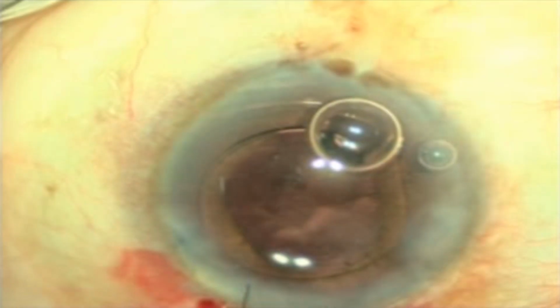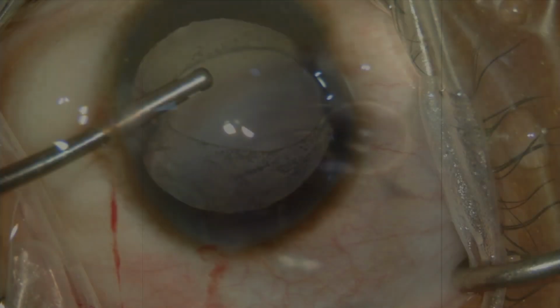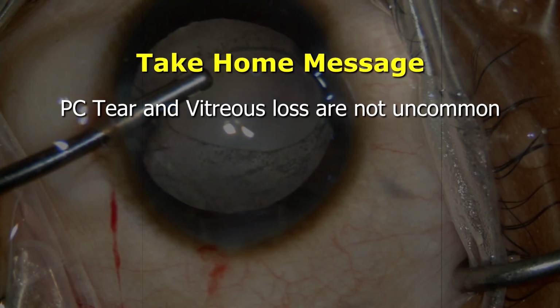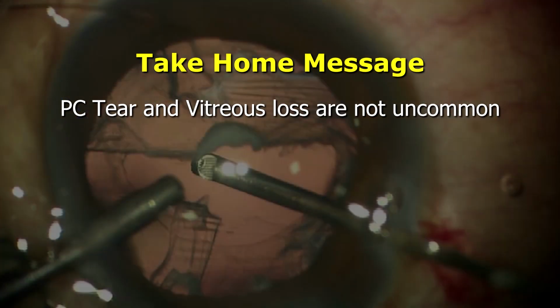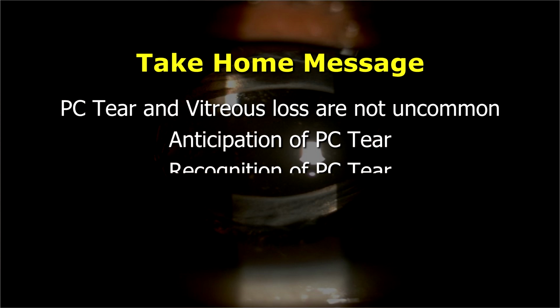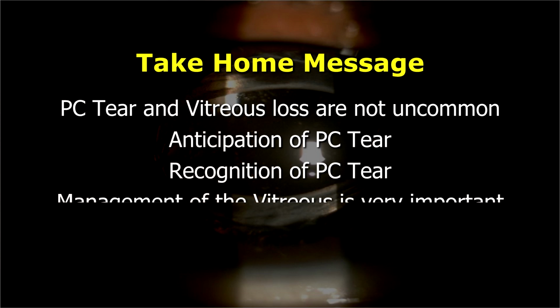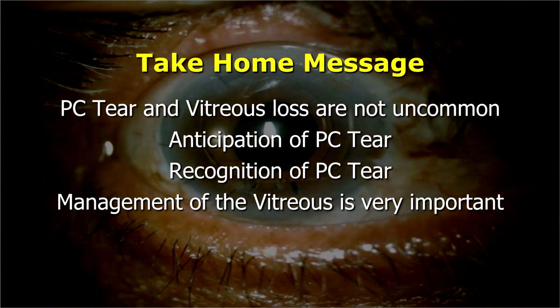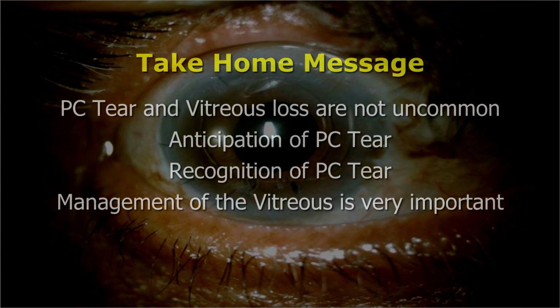The take-home message is PC tear and vitreous loss are not uncommon. They can occur even to experienced surgeons. Anticipation of the PC tear, recognition of the PC tear, and management of the vitreous is very important for the good outcome and long-term outcome for these patients.